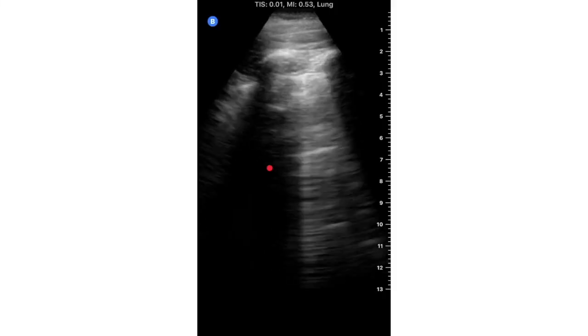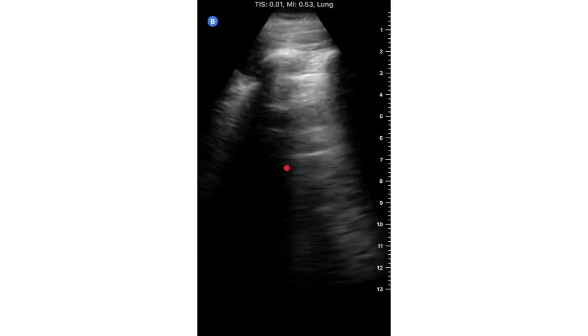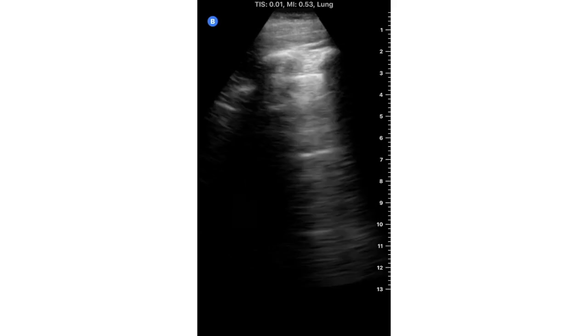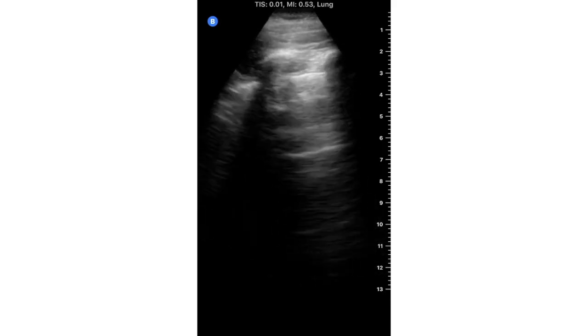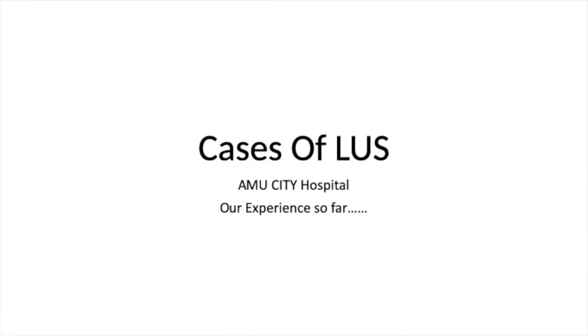Recovery. So this is really important because as patients get better, they start getting their A lines back. And here's a case of that. You can see the patient's got A lines, these bright transverse lines, but there are also some B lines as well. But this is a good sign because clinically the patient is getting better, and it can reassure us that things are heading the right way.